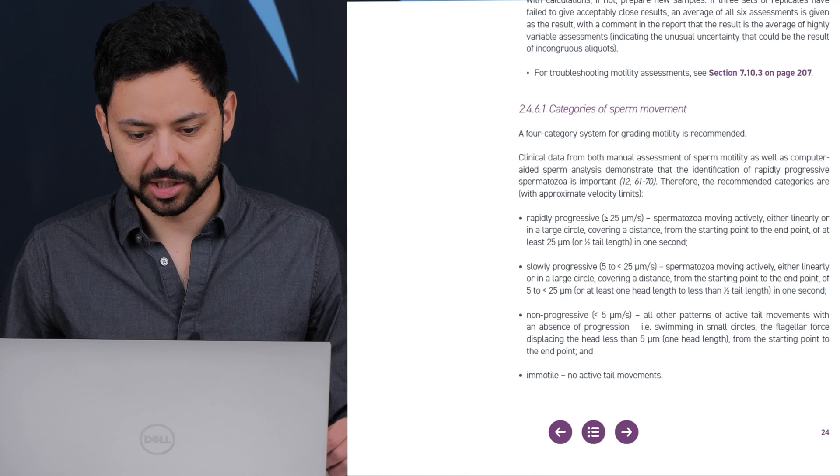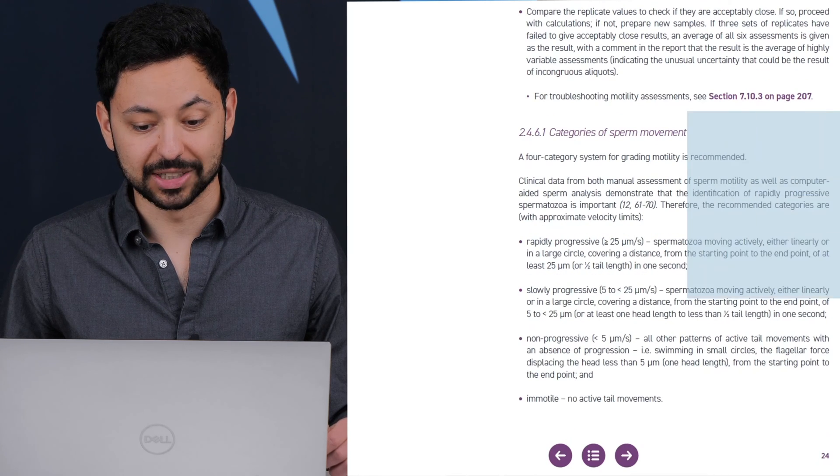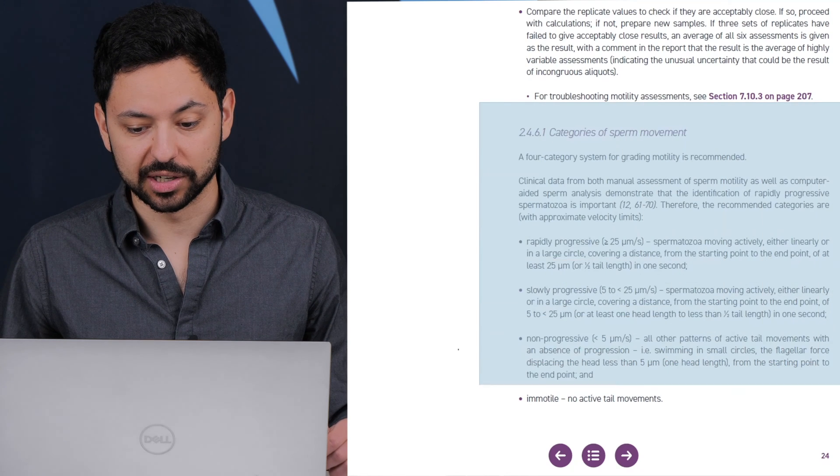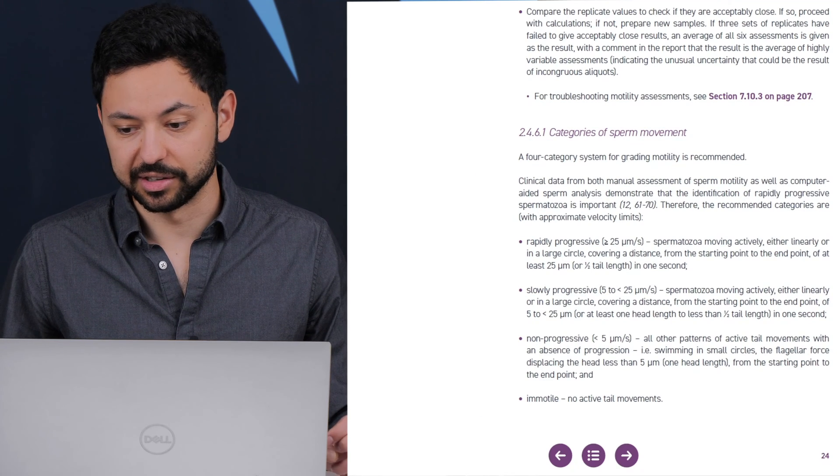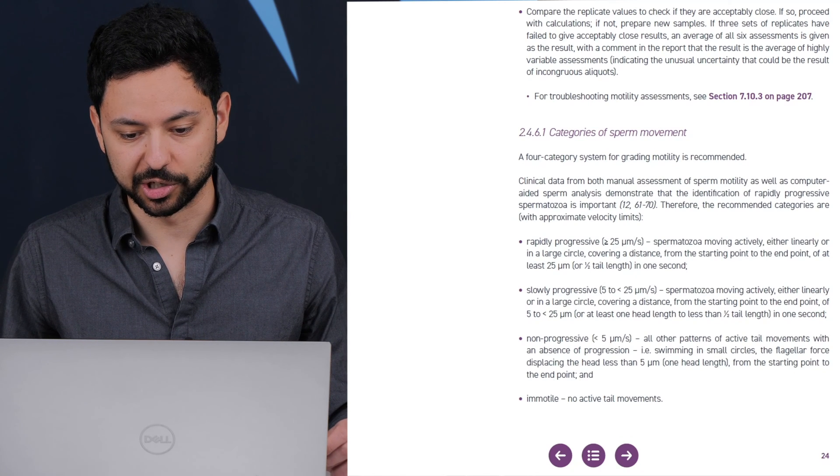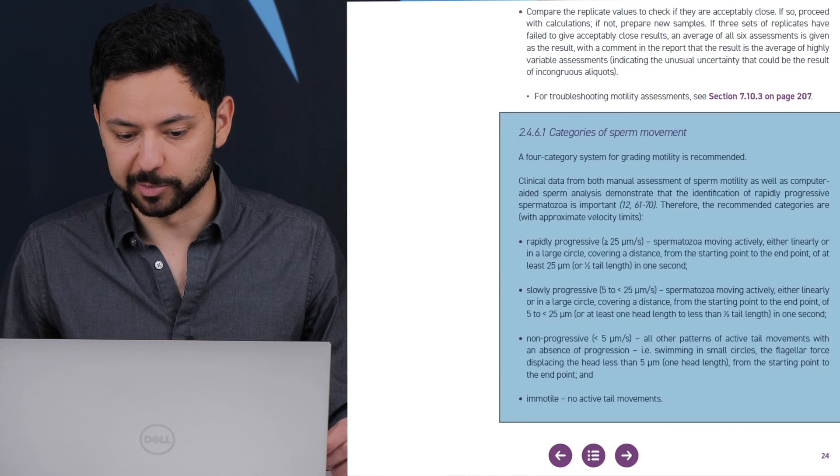If you take a look at the World Health Organization document, they have a couple of categories for assessing the sperm movement that you have going on here. And this is significantly simpler to do than sperm counting. So you could absolutely follow this and make a determination on your own of what your sperm movement metrics are.